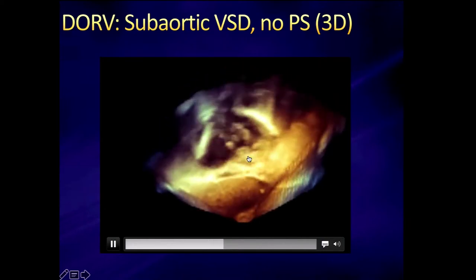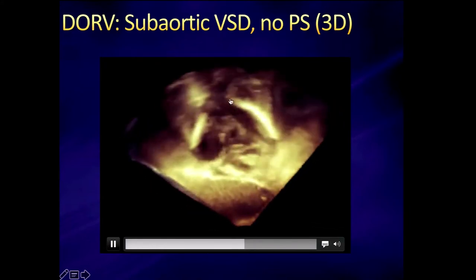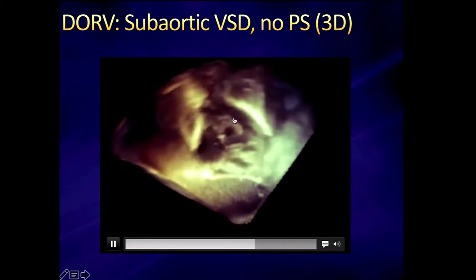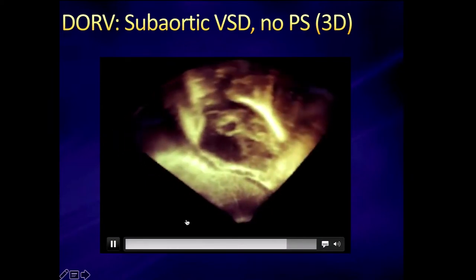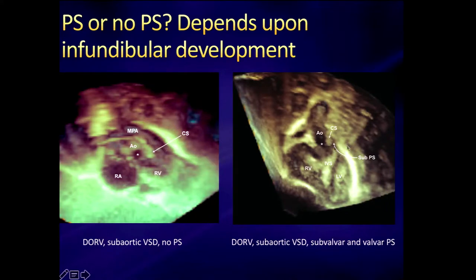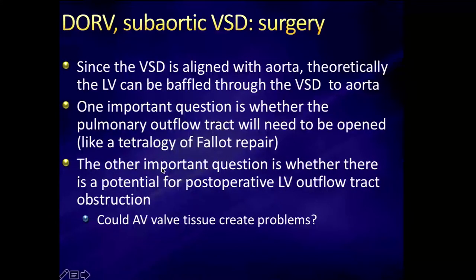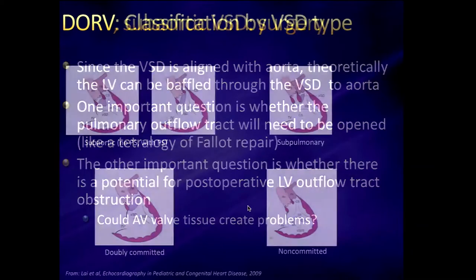This patient is not going to behave like a tetralogy of Fallot — not going to be cyanotic. Quite the opposite: this patient is probably going to be in a fair amount of heart failure. On 3D, rotating this around, there's the VSD itself, the septal band, the pulmonary valve, and the aortic valve. Both semilunar valves are on the right-hand side; the aortic valve is really completely over. Since the VSD is aligned with the aorta, the LV can theoretically be baffled from the VSD to the aorta, and the key question is whether the pulmonary outflow tract will need to be opened, as in tetralogy of Fallot.